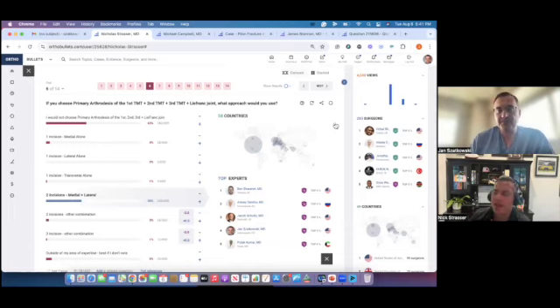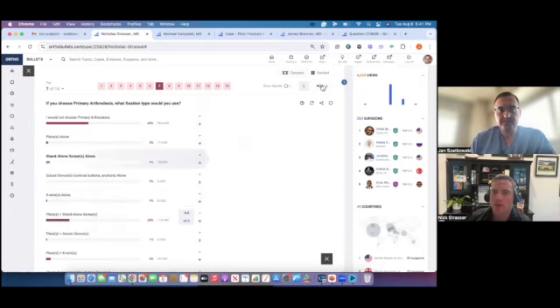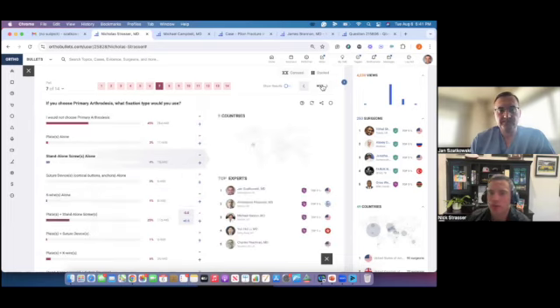Right, and I think that's a good point. In an acute situation like this, they're probably going to follow everything because you're getting to it pretty early on. If it's more chronic and scarred in a little bit, I could definitely see a situation where you have to do a separate incision or a separate approach to the fourth and fifth and actually clean it out to get that to reduce. You may have to do that to get the whole foot reduced, to be quite honest, because that stuff gets kind of sticky over there. And then it would make sense that you maybe have to pin it in that case.